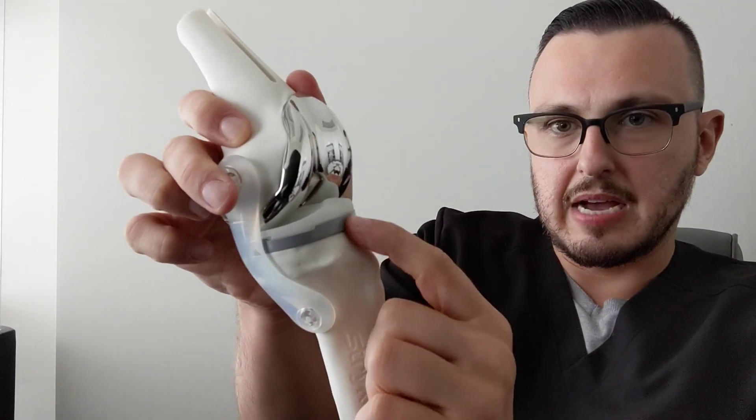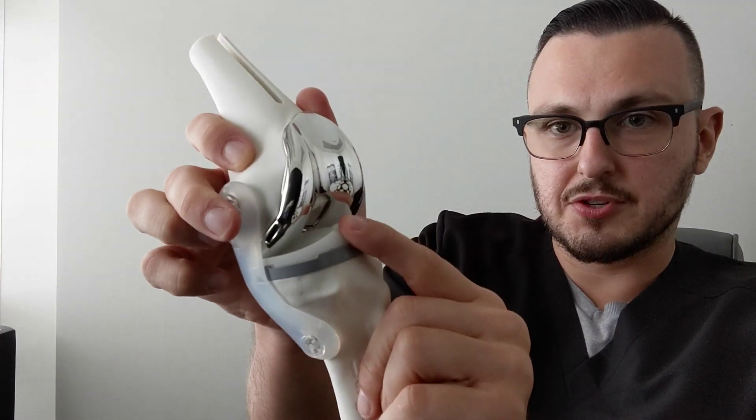So a knee replacement is you have the metal component on the femur, which is your thigh bone, and then you have the metal component on the tibia and then a plastic spacer in between the two where the articulation occurs.